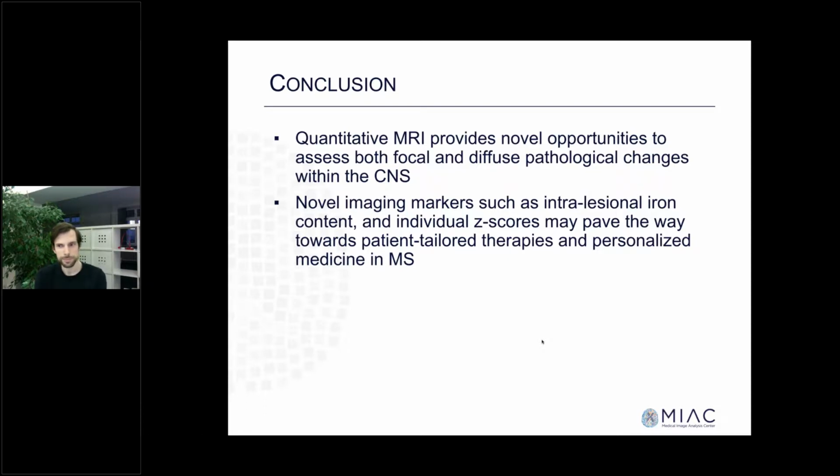Okay, great. So how about T1, T2 relaxometry? Is it possible on 3T scanners? Yes, I think 3T is perfectly suitable to create T1, T2 maps, especially the MP2RAGE sequence is great at 3 Tesla and produces really nice images. And for example, the z-scores and the normative values and atlases I showed you previously are based on 3T scans.